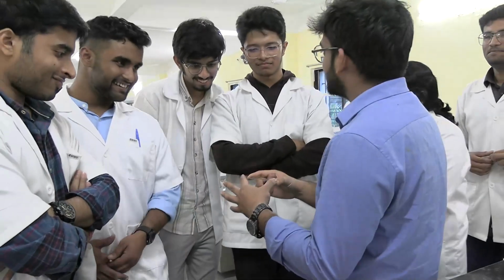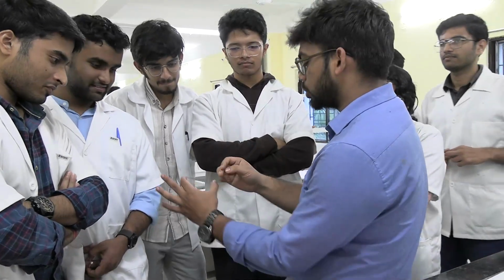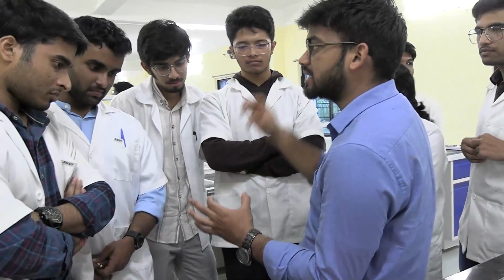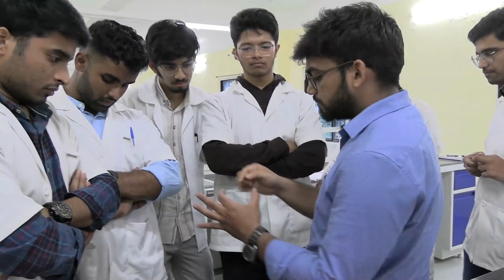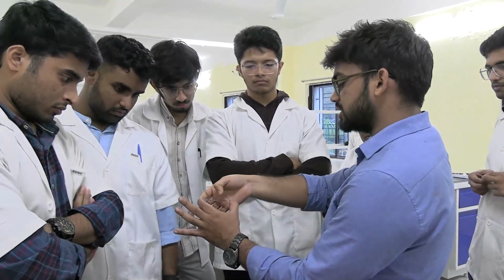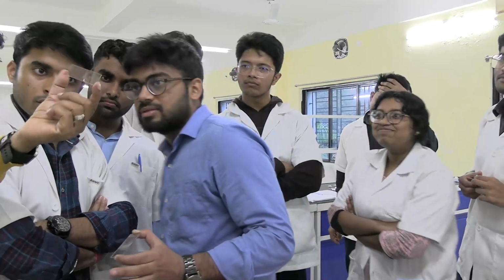Then you are going to focus just a bit behind the tail end, not at the head end. At the head end you are going to see clumps of RBCs, where you will find very few WBCs. It will be difficult to identify also. So you look just behind the tail part of the smear.